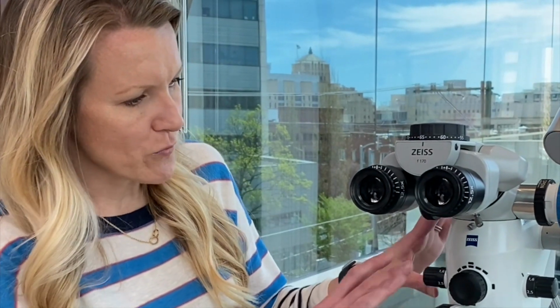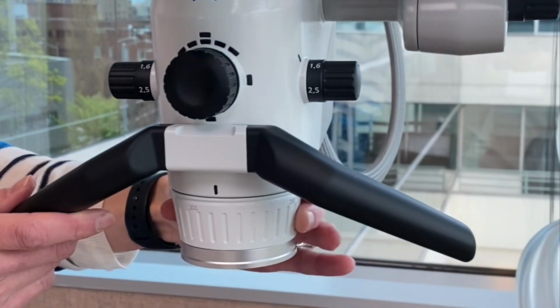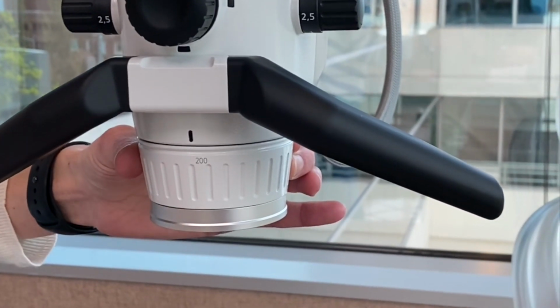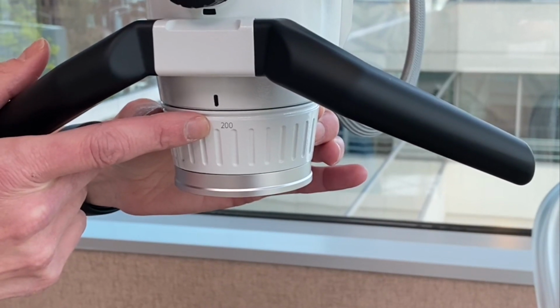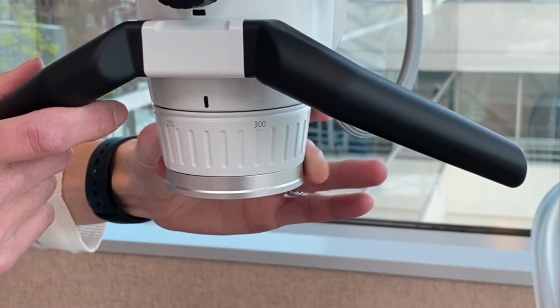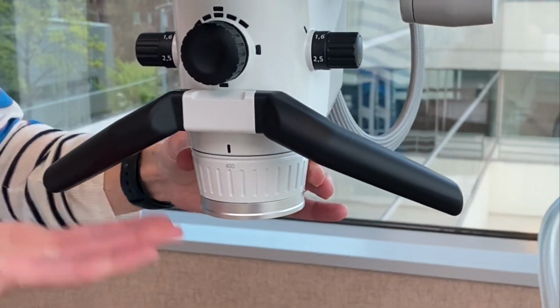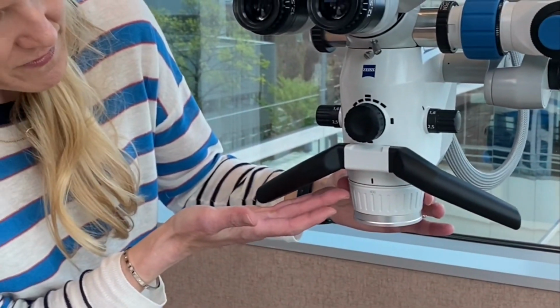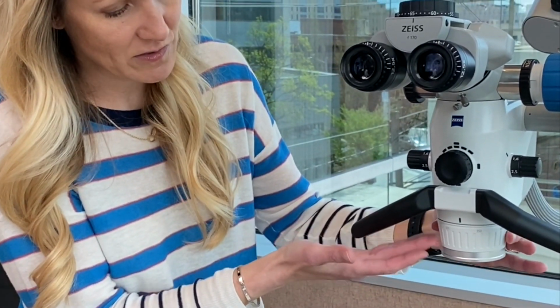Okay, we are going to go down now to probably the most important part of the scope, and this is your objective lens here. The reason it's called an objective lens is because it's closest to the object that you're working on. So this one, you can see the numbers there. It goes from a 200 all the way up to a 400. And there's either a single lens or a series of lenses in here, depending on the scope, that has moving parts. As we're rotating it and the lens is moving, it's allowing us to change the focal length of the lens.